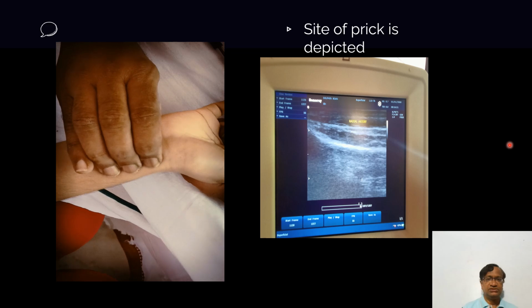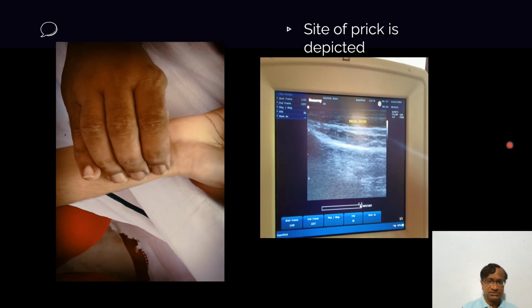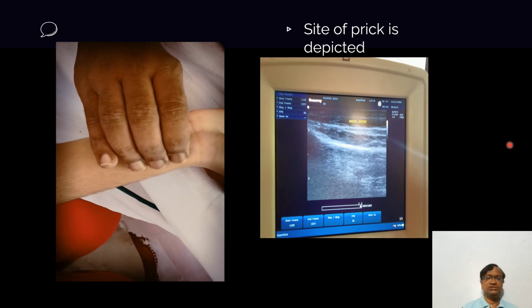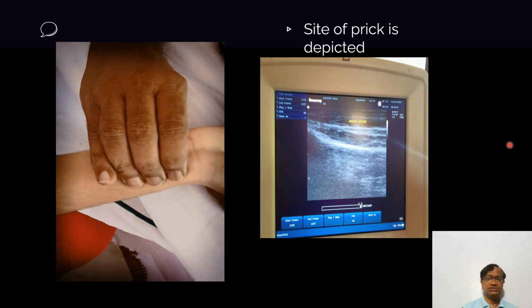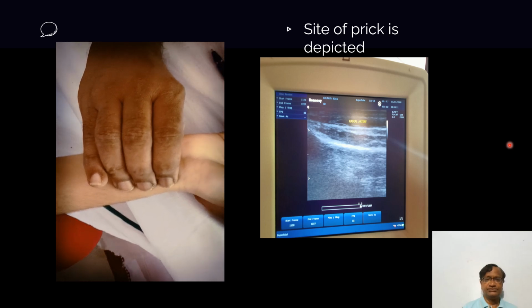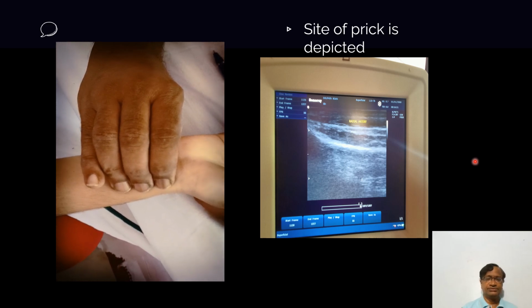Even if you feel very well, just check this side and that side. Don't do like this. Don't do like this. If you are not feeling good, then check it here. Choose the way you are comfortable and where the pulse is of good volume.